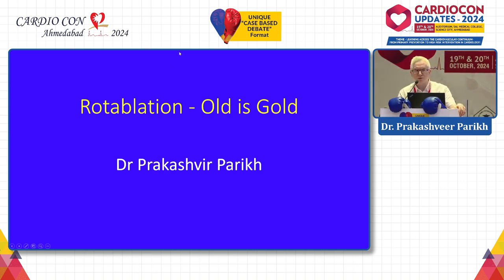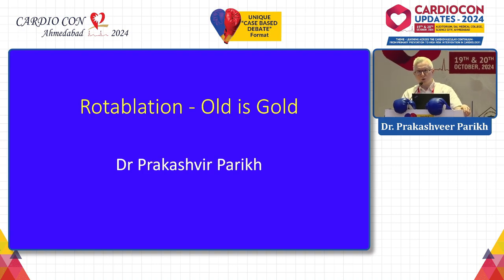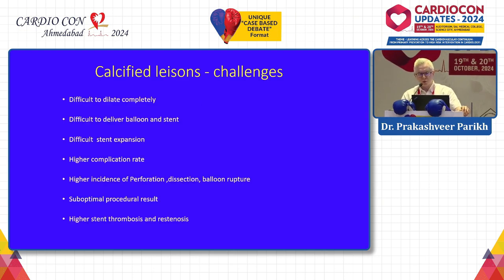Good morning, friends. In this session, we are going to discuss the management of heavily calcified lesions in general. I'm going to speak on rotational atherectomy, which is a very old device but still has no competition so far. It's the most effective device to treat heavily calcified lesions. Calcified lesions are difficult to treat.